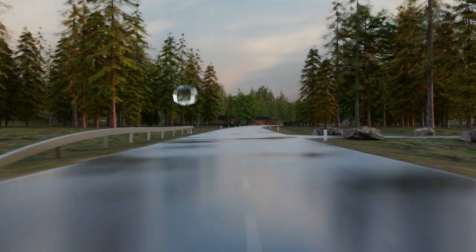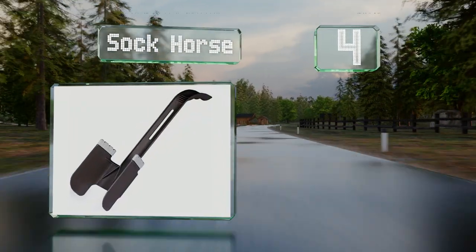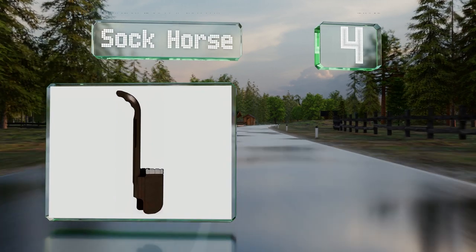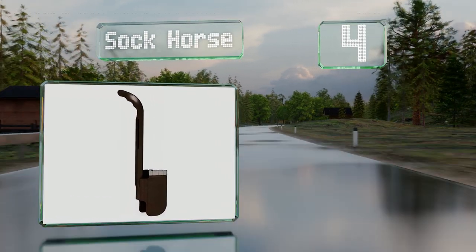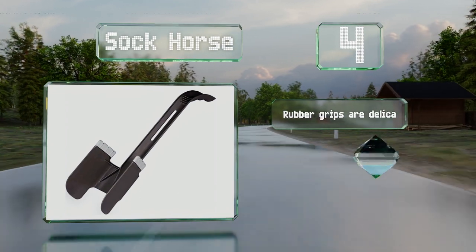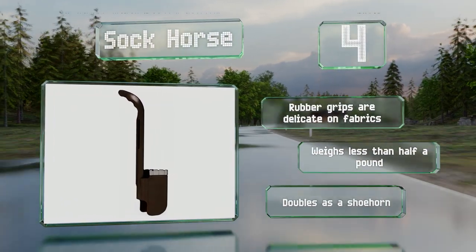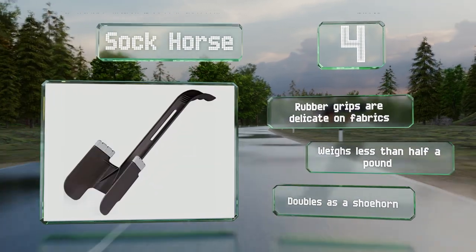At number 4, the Sock Horse can be a major help thanks to a handle that's longer than those on many other models. The plastic doesn't touch your skin too much in order to not irritate those with sensitivity issues. Its rubber grips are delicate on fabrics and it weighs less than half a pound. It also doubles as a shoehorn.